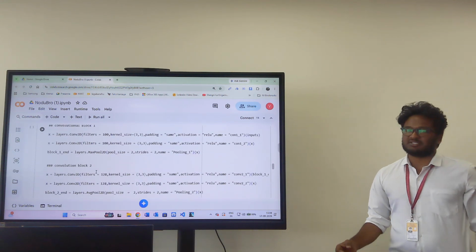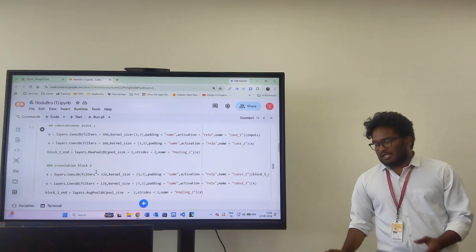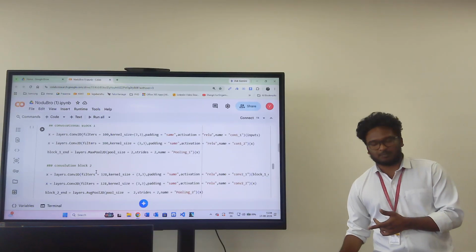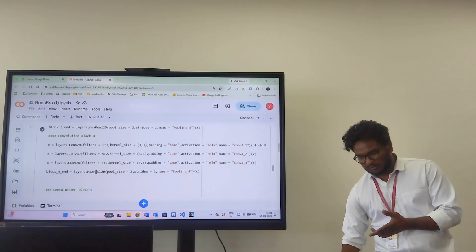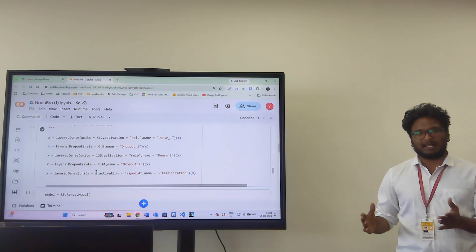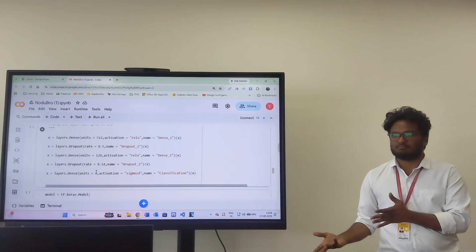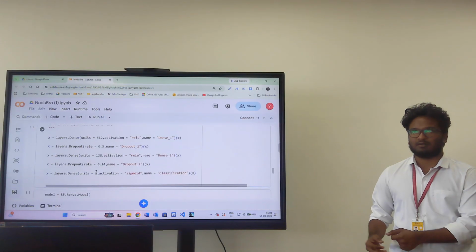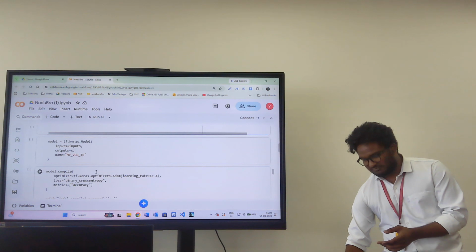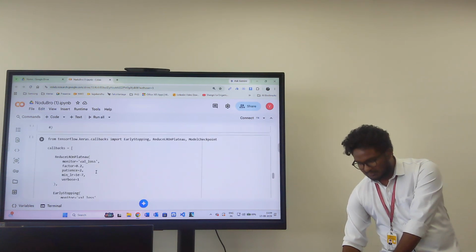And this is my own model, which I created myself by taking reference from the VGG16 model. In VGG16 you use only max pooling everywhere, but here I used average pooling also, two times. When you compare this model with the VGG model, the parameters were decreased by nearly 55%, and the size is nearly 150 MB, whereas VGG is nearly 500 MB. So there is a huge difference. And then this is my approach and training.